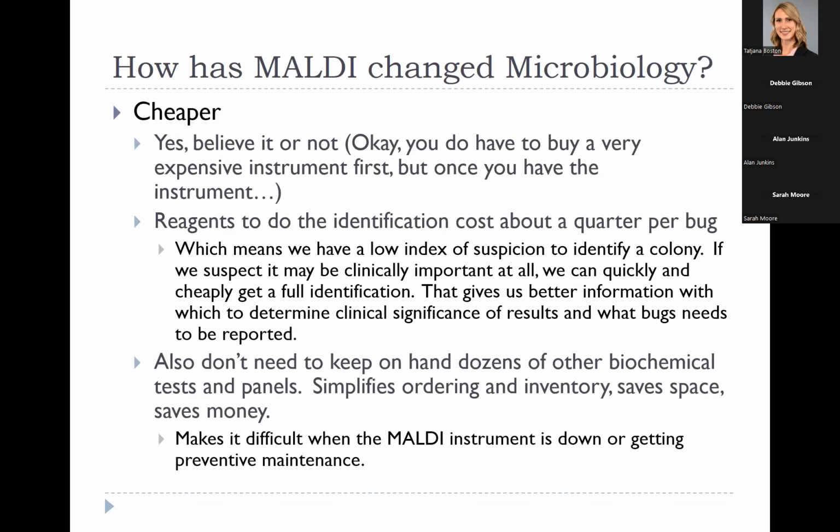When you do find information, you run into another problem. This is not something I'm fussing about with MALDI, but something I'm fussing about in the literature in general. You get a lot of non-specific case reports: a bug was associated with something, or it was isolated from something. For example, here's a bug that we get fairly frequently now.